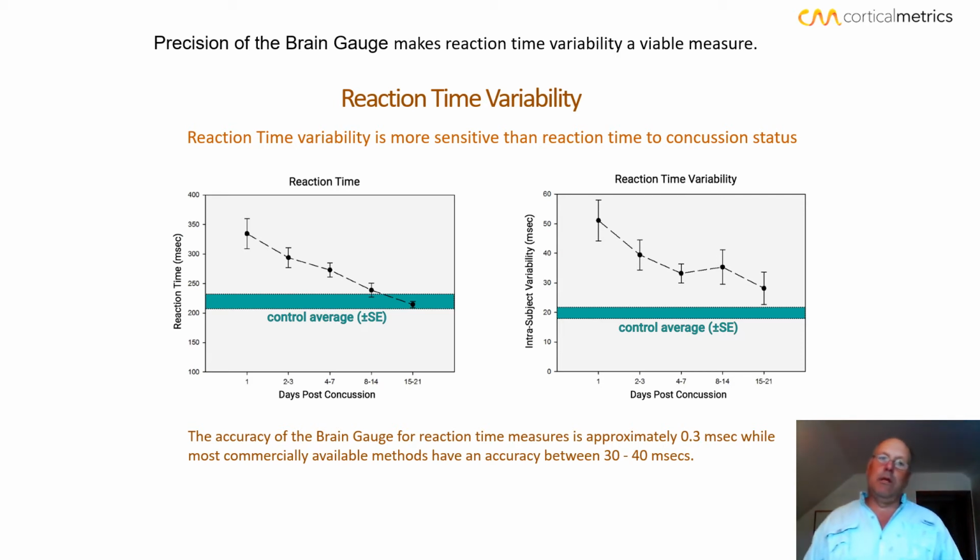And reaction time variability is very sensitive to white matter integrity and also attention. You can think about how it's affected by attention: if you can't pay attention on the task, then your numbers are going to bounce around a lot. Like I mentioned, 160 to 200 to 240, your numbers will bounce around in those values quite a bit because you're really not focused and you're having trouble paying attention. So even though your reaction time might be overall average the same, your variability shows up.